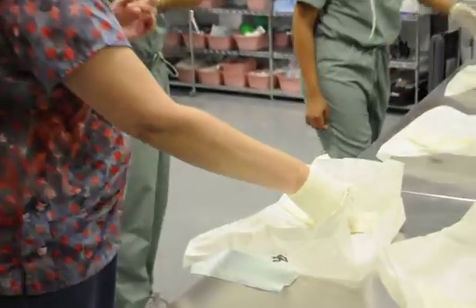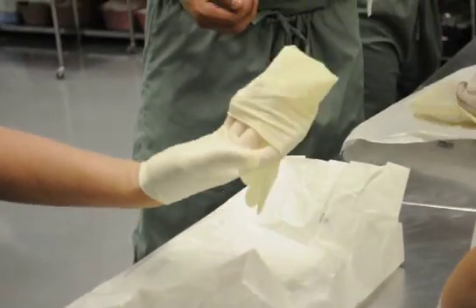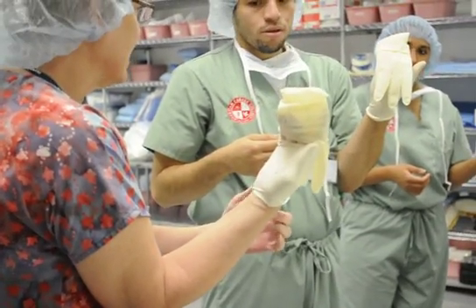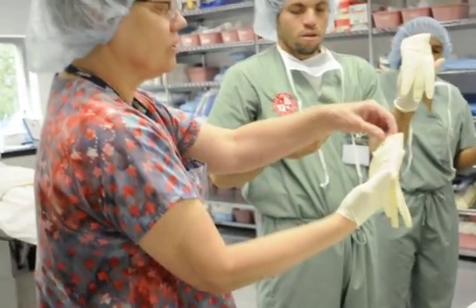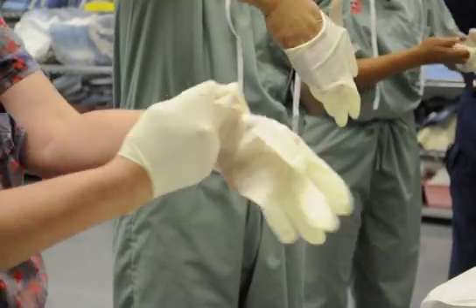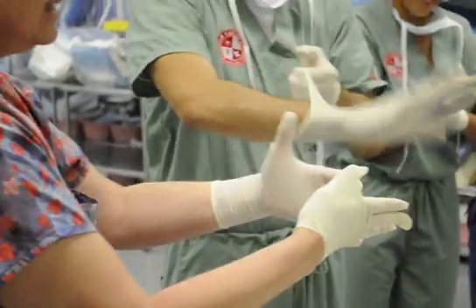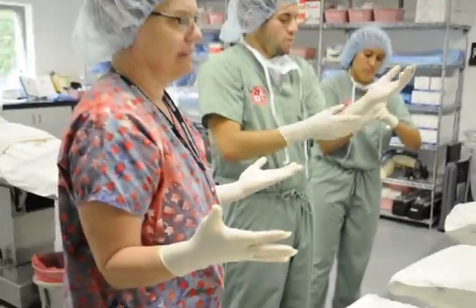Then you're going to pick up the second glove at the inside cuff. Making sure when you do this, if you have the glove long, the fingers don't come back and touch, especially if you haven't pulled down the cuff yet. Keep tension on it — that's one way to do it — then go around and pull it up. Come back to this side and do the same thing and pull it up.